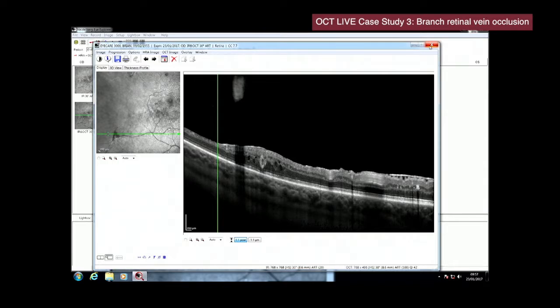If we see vitreous hemorrhage, that means that we need to do more laser. Otherwise, more ischemia, more hemorrhage, patient can develop neovascular glaucoma. We need to prevent that. Usually that is not very common after branch vein occlusion, but if we see vitreous hemorrhage, that means some vessels are still leaky, so we definitely need to do some laser treatment here.